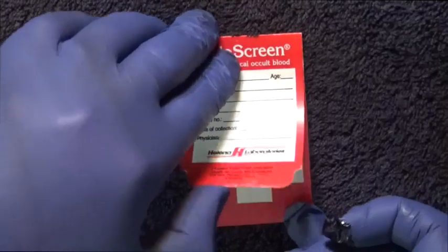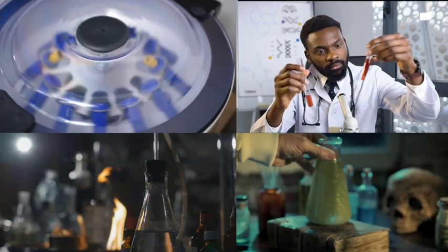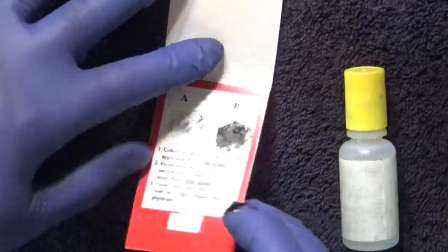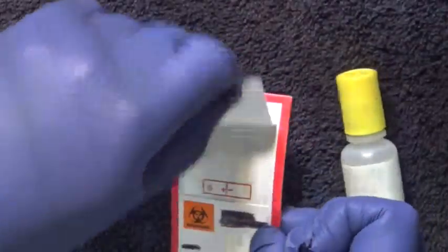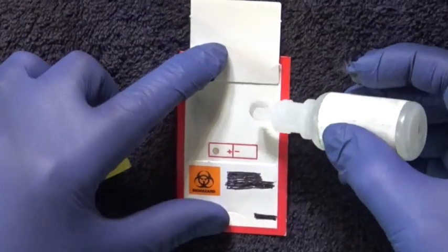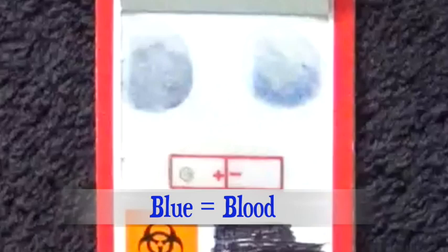Now, in some hospitals you just collect the stool specimen and send it to the lab. They run the test and tell you the result. But in many hospitals, you'll be expected to run the test yourself. It's not hard. All you do is flip over the card and apply a few drops of hemocult developer to the specimens and control test spots, and you wait a full minute. Any blue color indicates the presence of blood.